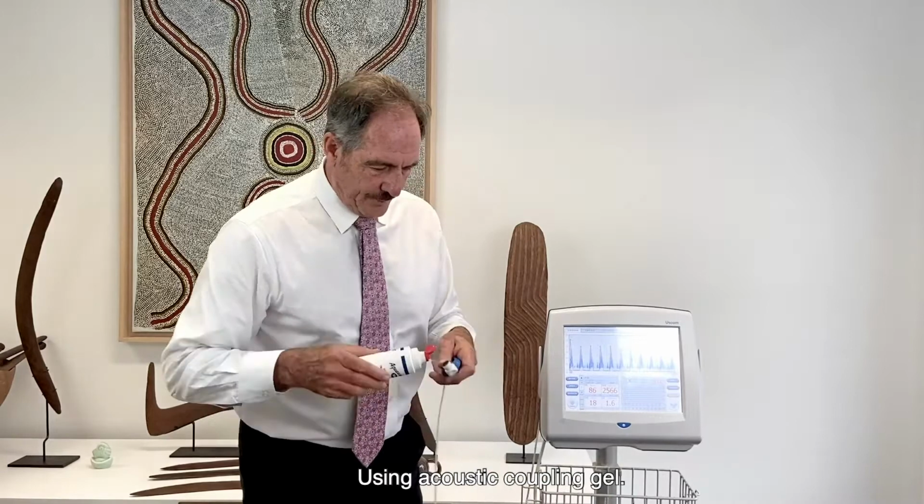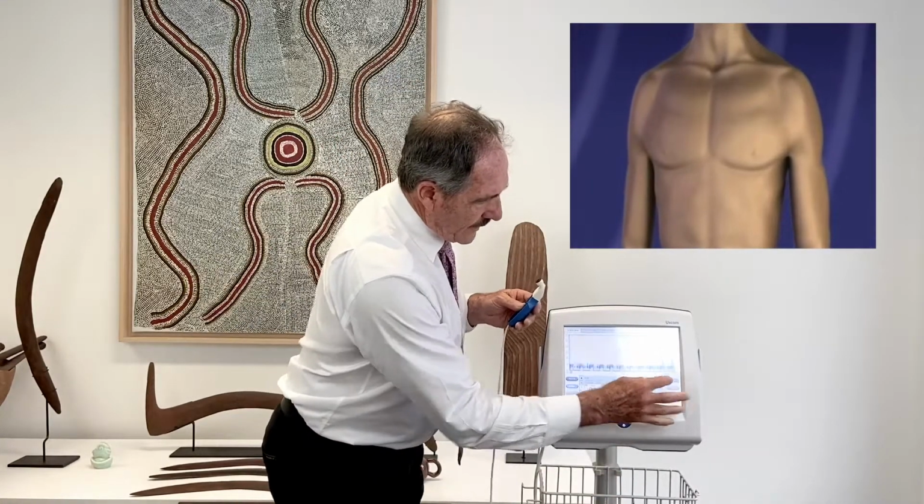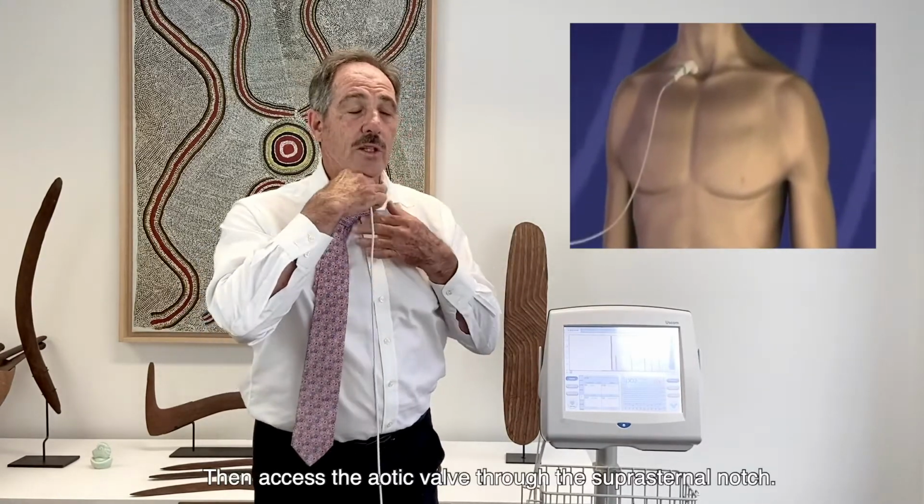Coupling gel. Put the device on. Access the aortic valve through the suprasternal notch.